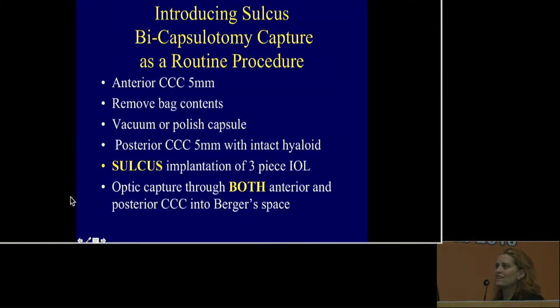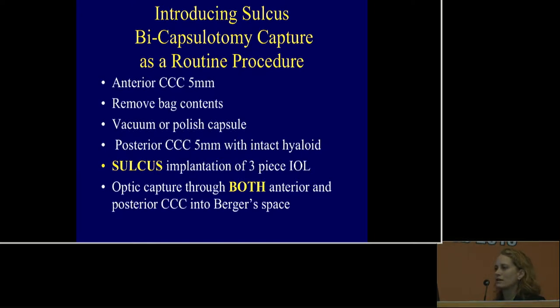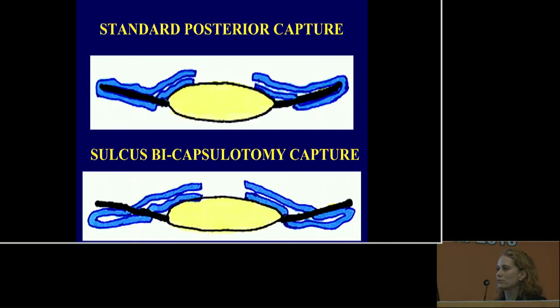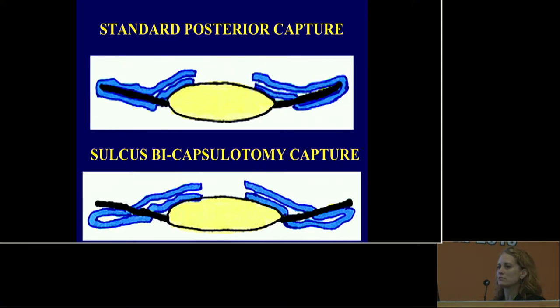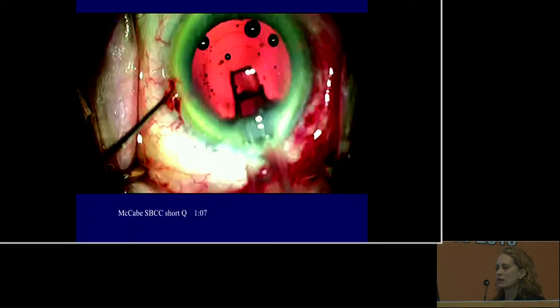What we introduce today is the sulcus bi-capsulotomy capture as a routine procedure. The critical steps are: an anterior capsulotomy about 5mm in size, removal of the lens from the bag, optional vacuum or polishing of the capsule, a posterior capsulotomy the same size or only slightly smaller, keeping an intact hyaloid and maintaining a two-compartment eye. The sulcus implantation uses a three-piece IOL, and the optic is captured through both anterior and posterior capsulotomies into Berger space.